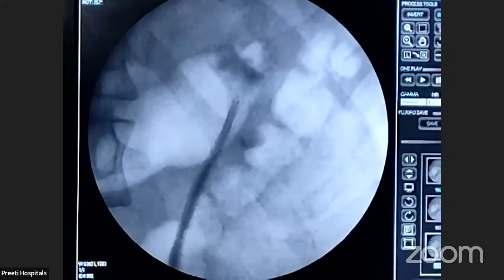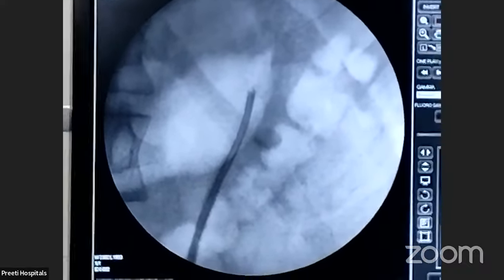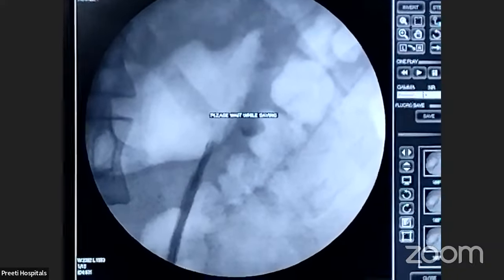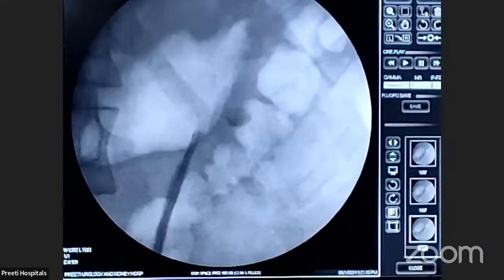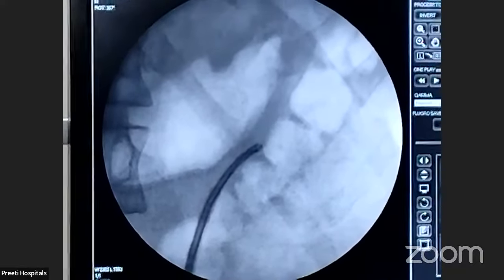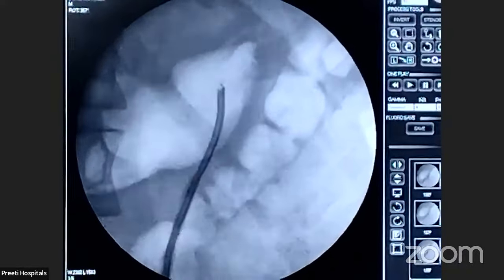Okay. Flush a little bit so that you will suck it out. See, now gone. Now this middle calyx, gone. Then this upper calyx part is over. And then this middle calyx, suck it out. This is also gone. Now, only some amount of upper calyx is there. No, see, yeah, that is also over.